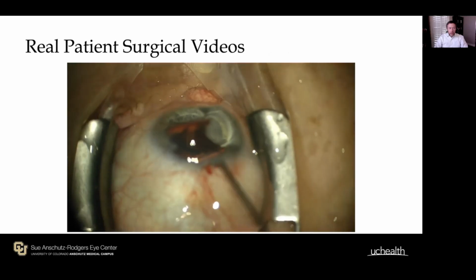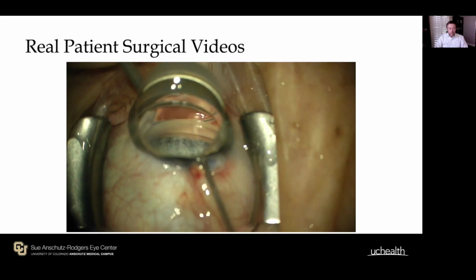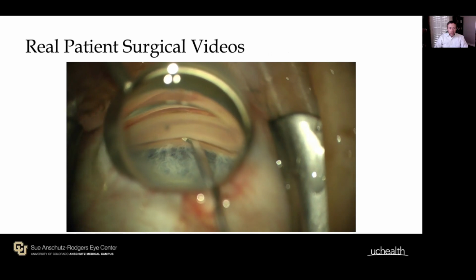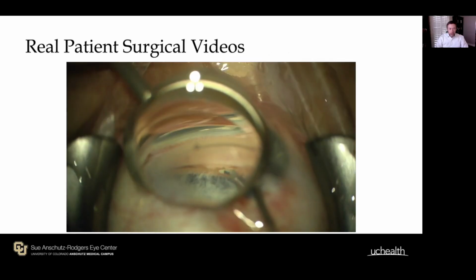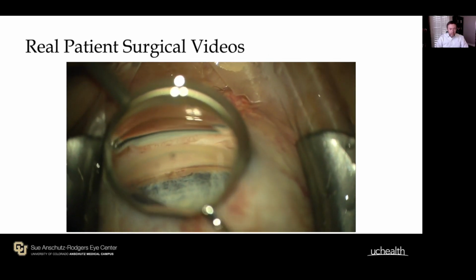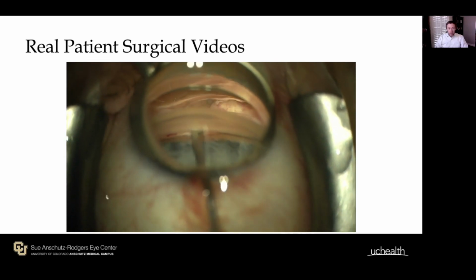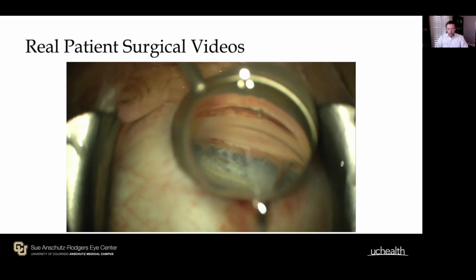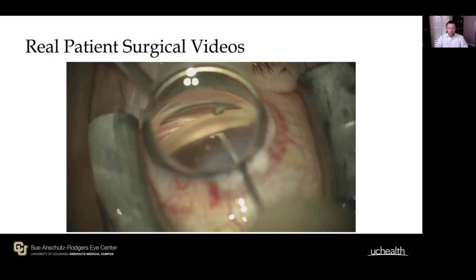And now moving on to actual patient cases. You can see the gentle side-to-side motion to get into the eye through the corneal incision. Again, zooming in is key. And then you can see the gentle upward tilting of the blade and the outward pressure it takes to get into the eye. Once you're in the canal, then you can see a nice gliding motion of the blade. Switching it over to a backhand now, this is that inside-out technique, and we're going as far as we can to the right as long as our view allows. And here you see a nice opening of the cleft.